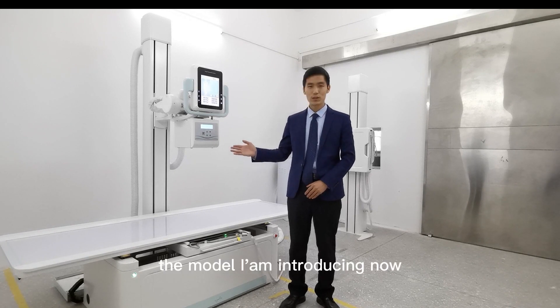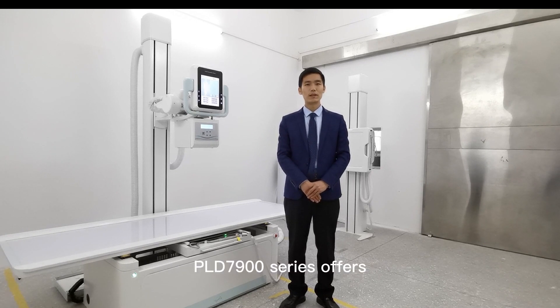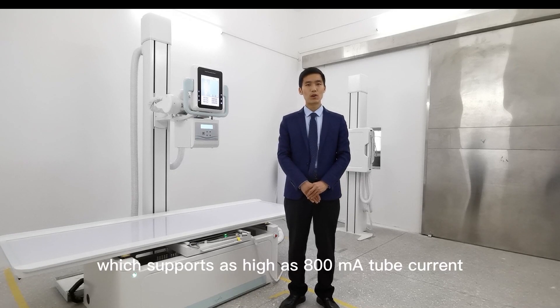The model I am introducing now is the most welcomed model in the market. The PLD-79-00 series offers different solutions of 50 kW and 65 kW for the customer's choice, which supports as high as 800 mA current.